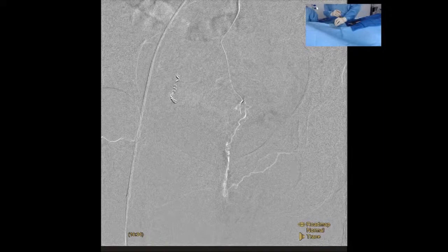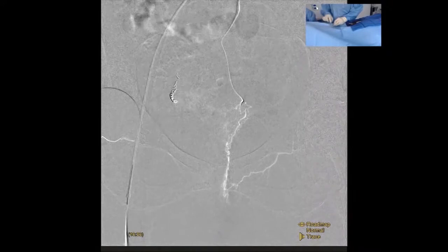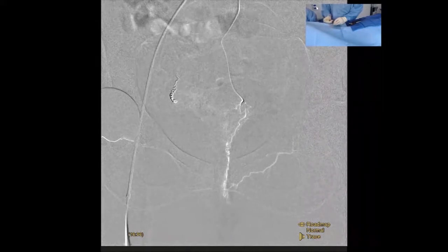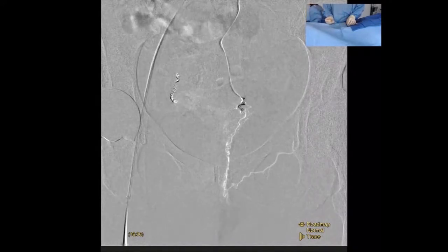If you do notice one thing here on the field, one thing you find interesting is that despite having this catheter, because of the amount of dead space eating up my base catheter, I don't really have a lot of microcatheter left. So what length? That's basically based on the length of your base catheter. Exactly. This is an 80 cm base catheter, and I'm going at least another 40 cm down towards this branch. And this is a 130 Tru Select. So 155 would easily be a comfortable length to use.